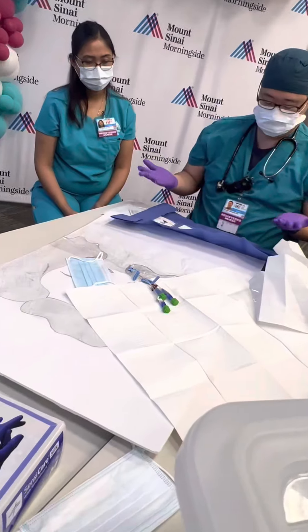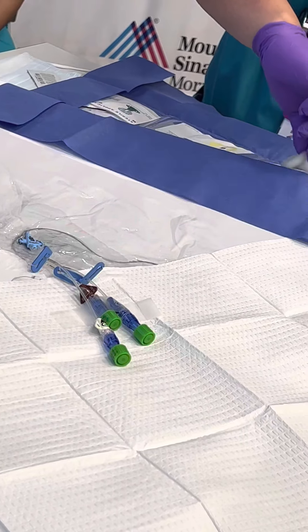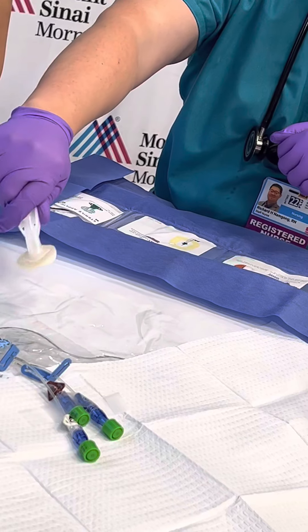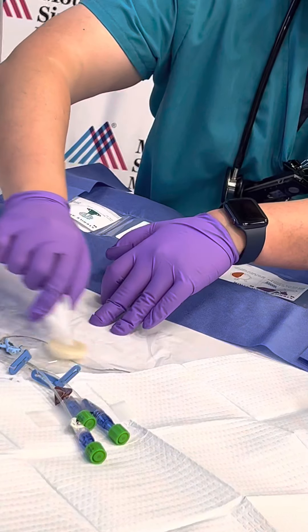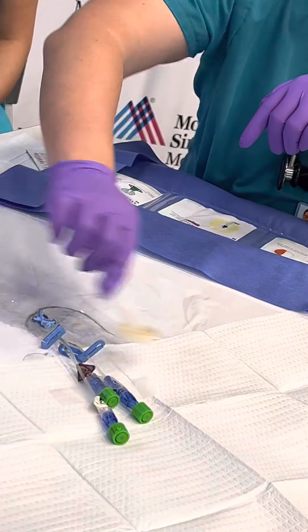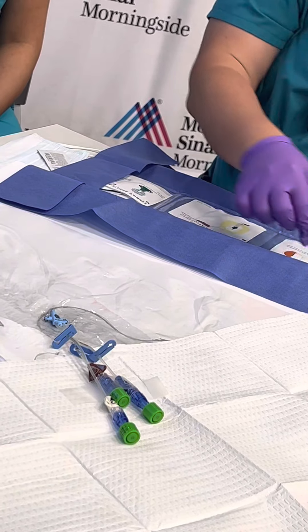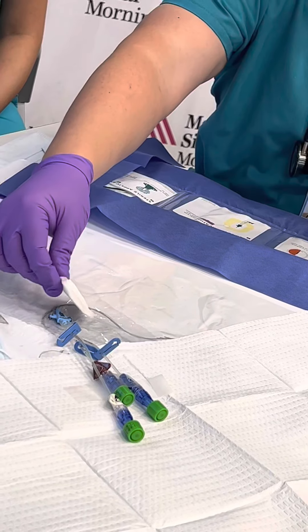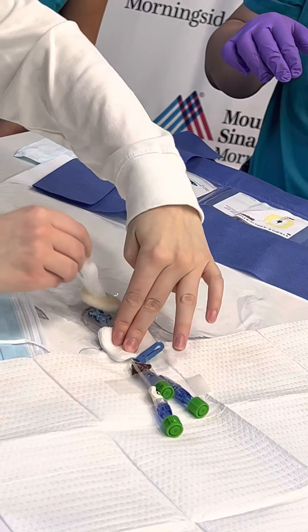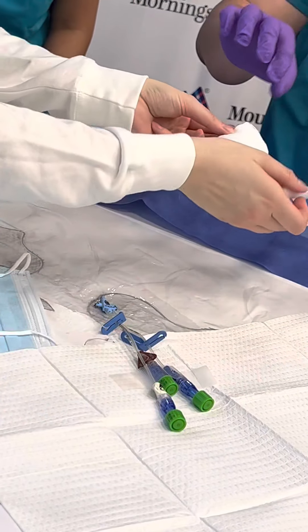Touch the outer corners — actually, don't do that. Just touch from the inside where it's still sterile, and grip this. You can use that little piece of gauze to hold onto the tubing while you scrub the insertion site. Take this piece of gauze — remember you're still sterile — if you want to hold onto your tubing while you scrub. Once you break sterility, dispose of that in a non-sterile field.